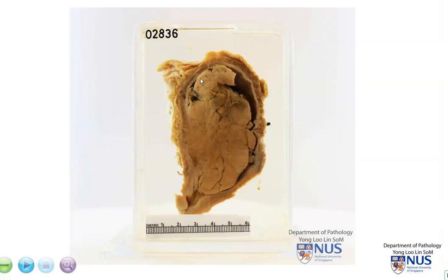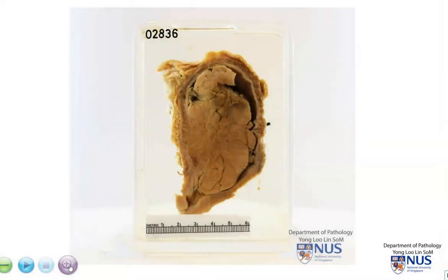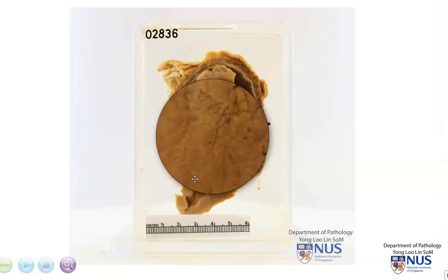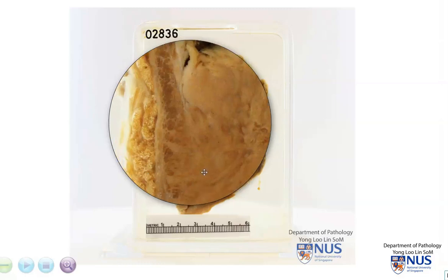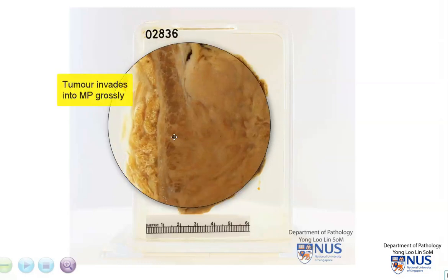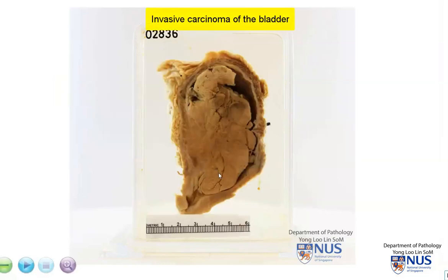What we can see here is a very large fungating tumor mass that is protruding into the lumen of the bladder and actually almost occupying the entire lumen. We want to focus on this area because the presence of invasion into the bladder wall is an important prognostic factor. Taking a closer look, we can see that this is the brown muscularis propria of the bladder wall, and this is the tan, fleshy tumor. It is quite clear that this tumor is infiltrating at least into the muscularis propria. So this is an example of invasive carcinoma of the bladder.